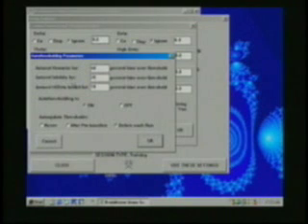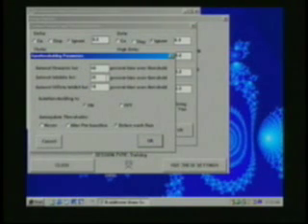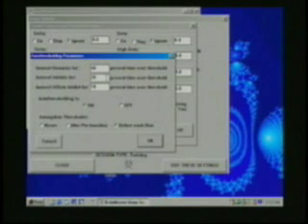For the inhibits, such as theta, we give a percentage of time over threshold. And these are typically between 20 and 50. In this case it's 20.